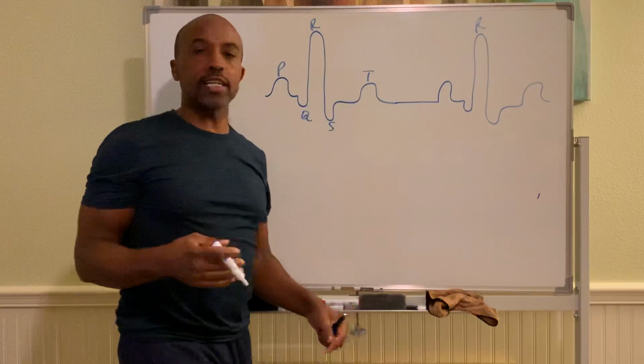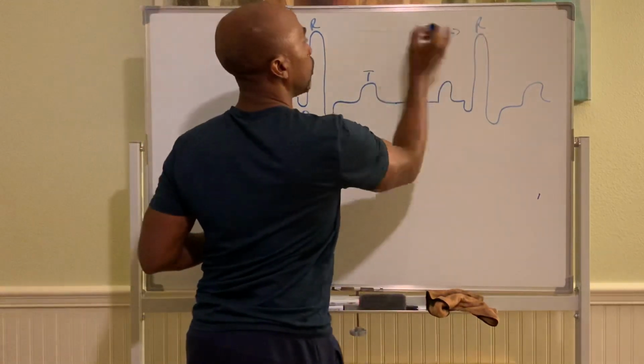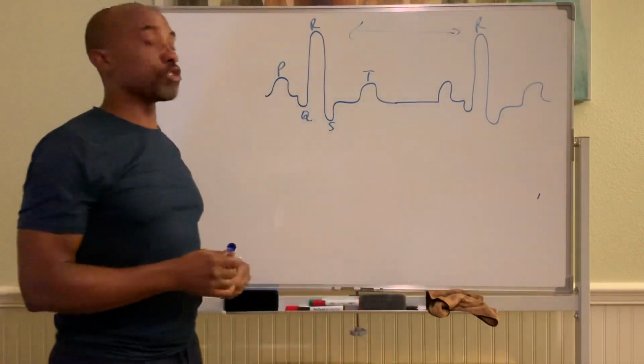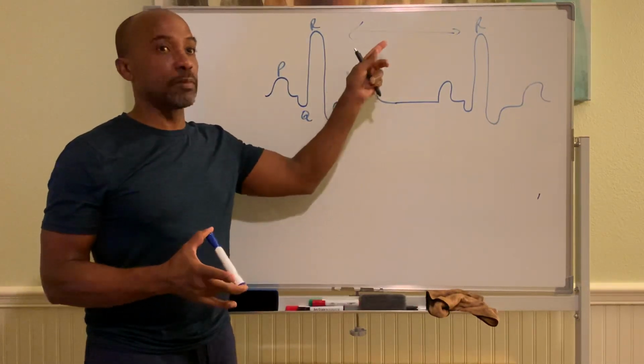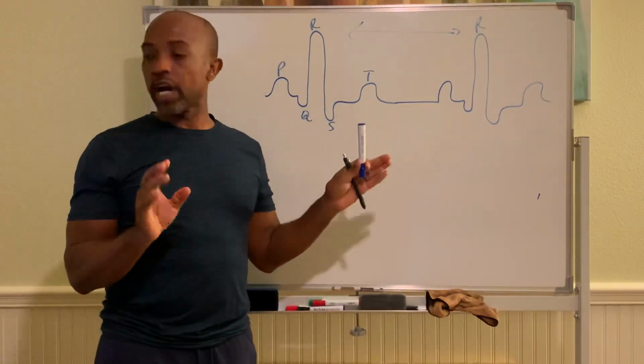That's being rhythmic, having rhythm there. So you can measure the R to R intervals for several EKG segments and see if it's regular, even for exercise as well as before exercise. That should still be regular, even if it's shorter and faster, it should still be regular.